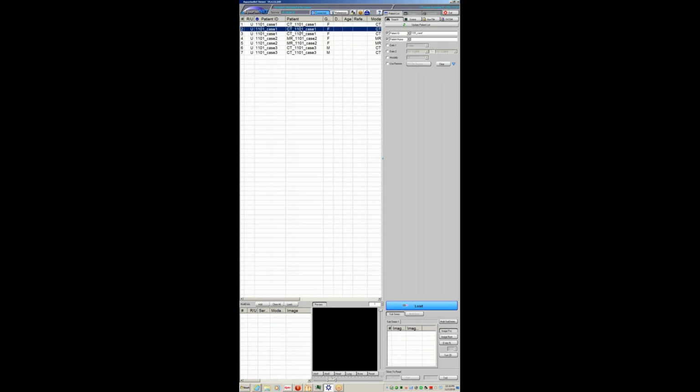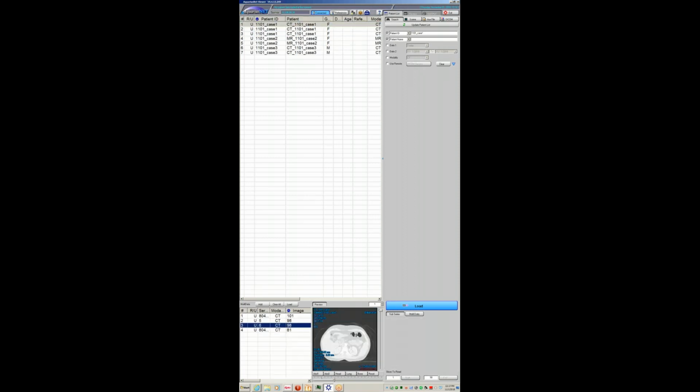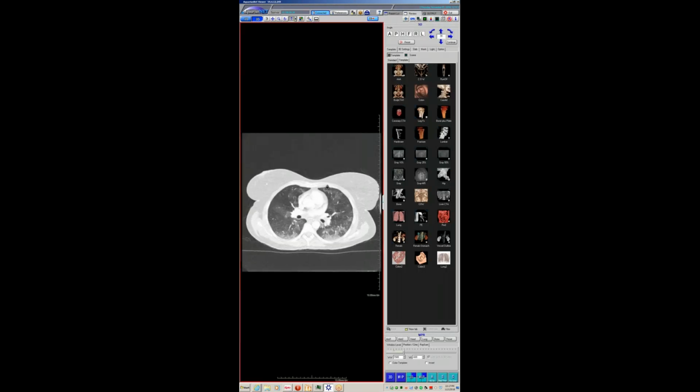This is actually, I like this case. I'm sorry, I like this case. It's just something I don't see that often. Actually, I just don't think we see it. Oh, the tops got cut off. I'll have to resend it.